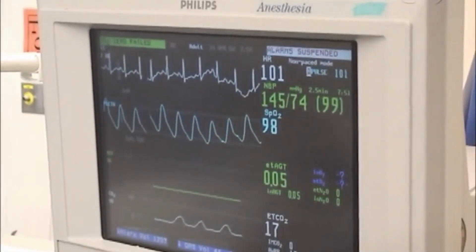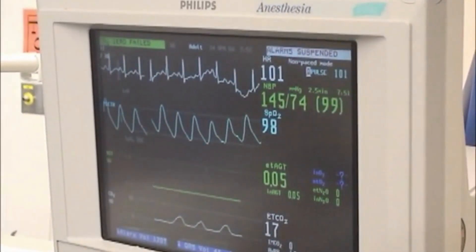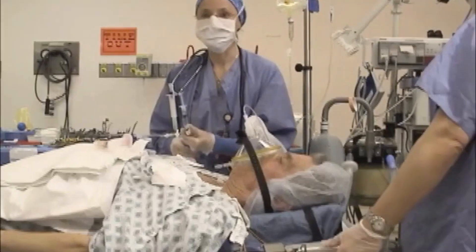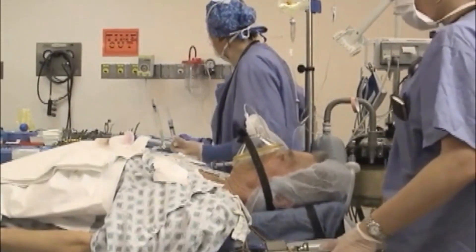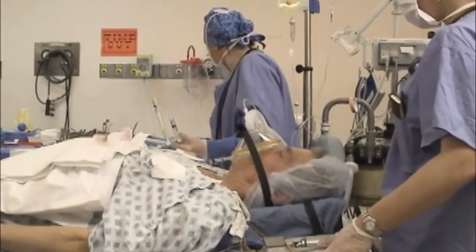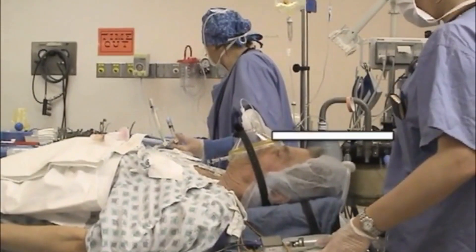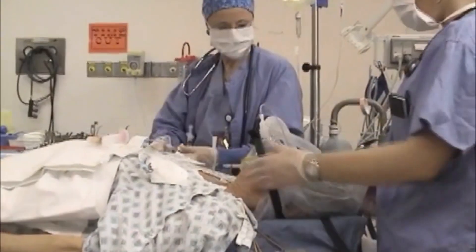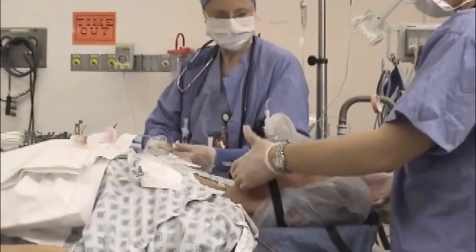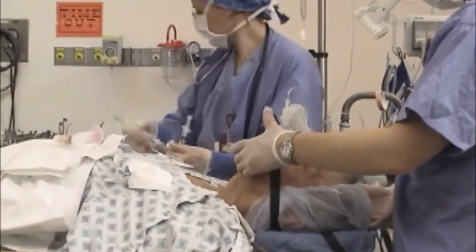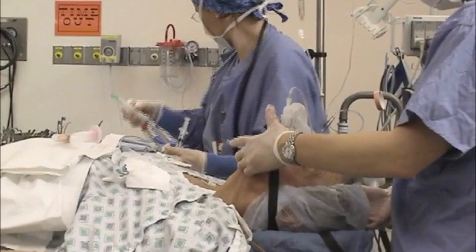If time and conditions permit, assign an assistant to watch the monitor during the procedure and report any changes. Adjust the height of the bed so that the patient's head is level with the lower portion of your sternum, unless otherwise indicated. Place the patient into the sniffing position by placing a pillow or folded towel under the patient's occiput.